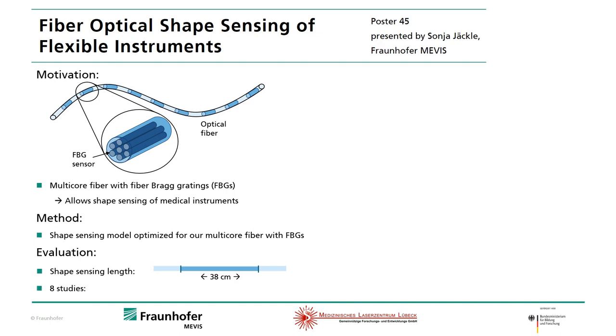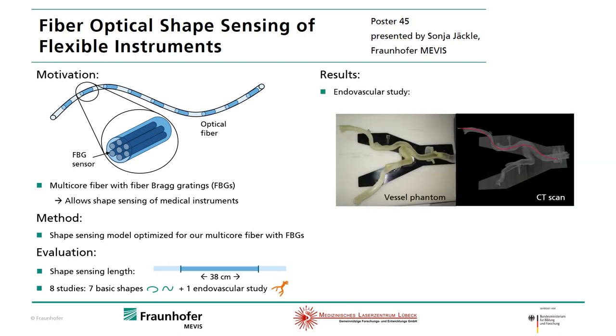We made eight studies: seven basic shapes and one endovascular study. On the right the result of this study is shown. The left image shows the setup and the right one the CT scan with the reconstructed shape in red. Here the estimated shape matches very well to the ground truth.